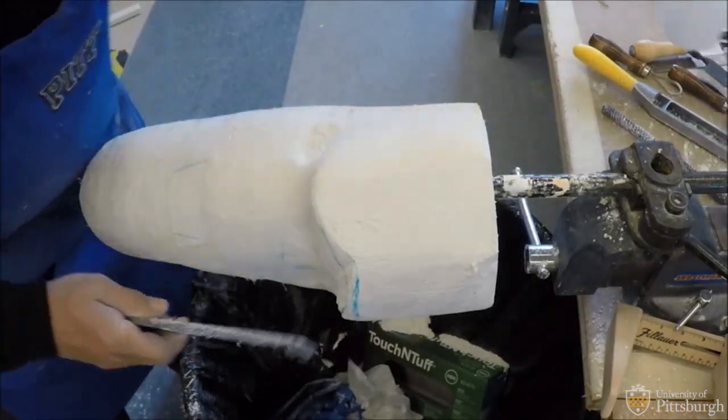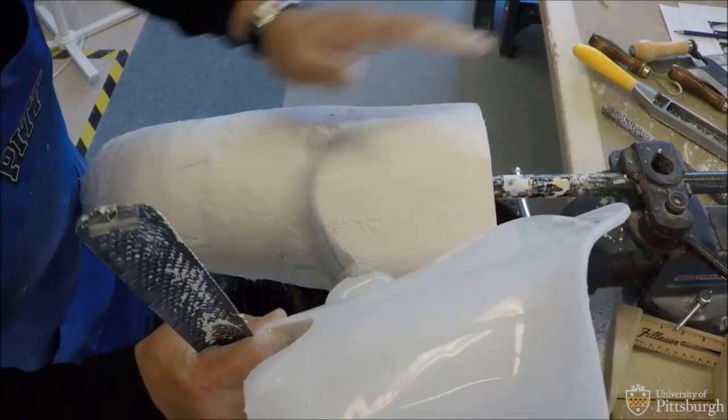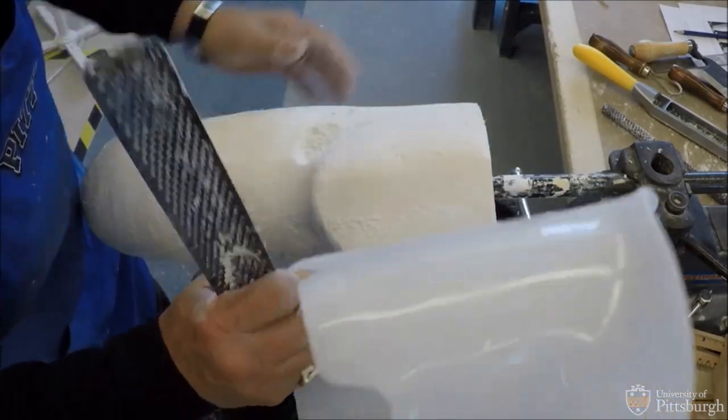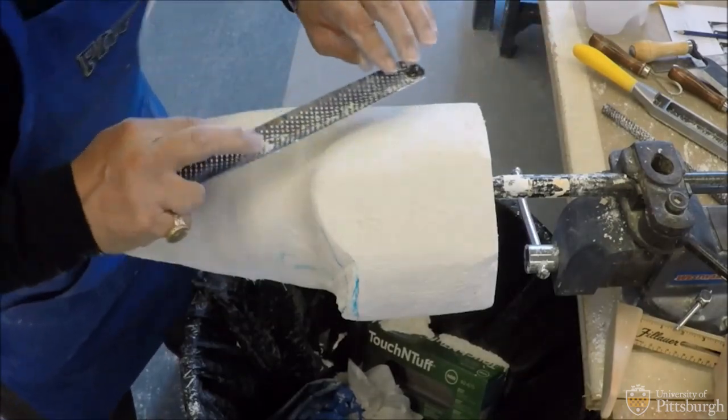Every once in a while I'll stop and look at my model here so I don't get lost. I'm getting pretty close. I need to get some cupping on the lateral wall.